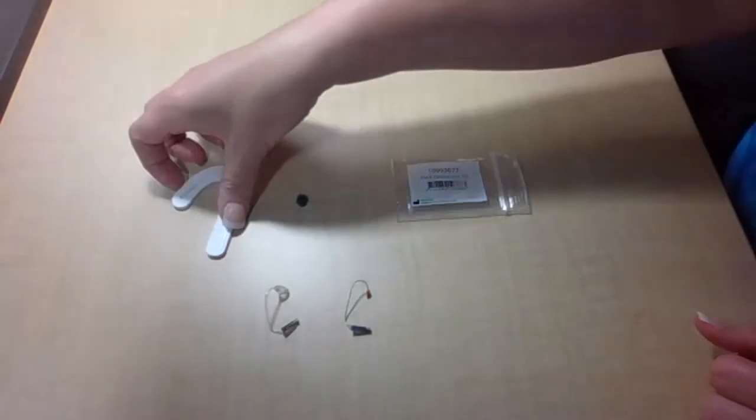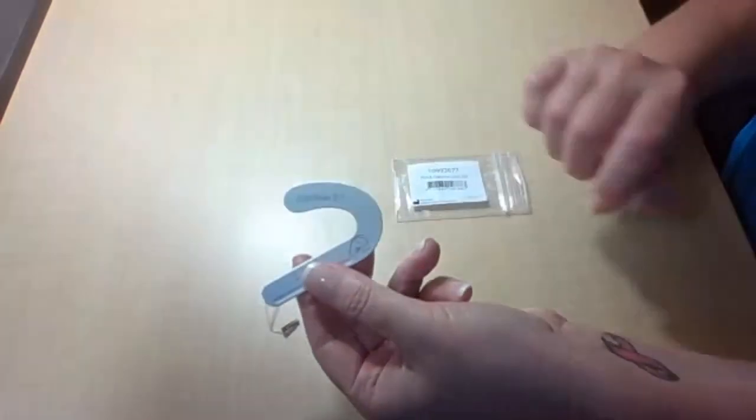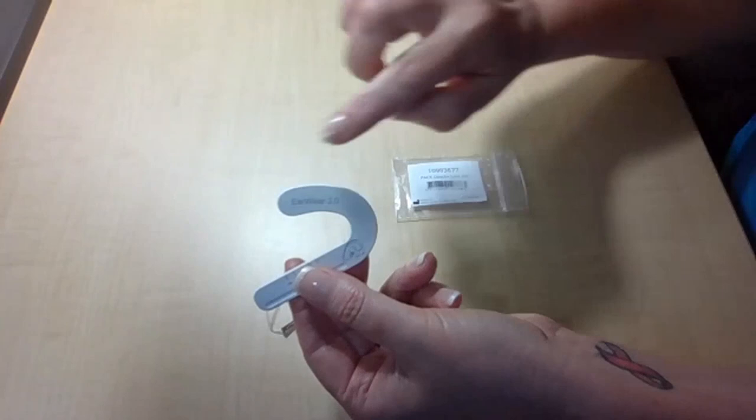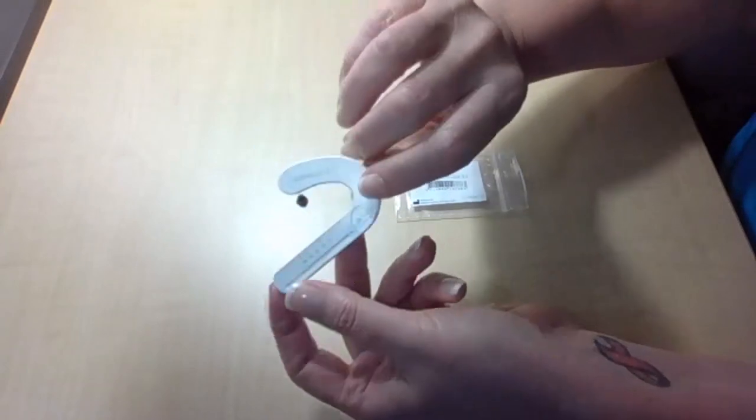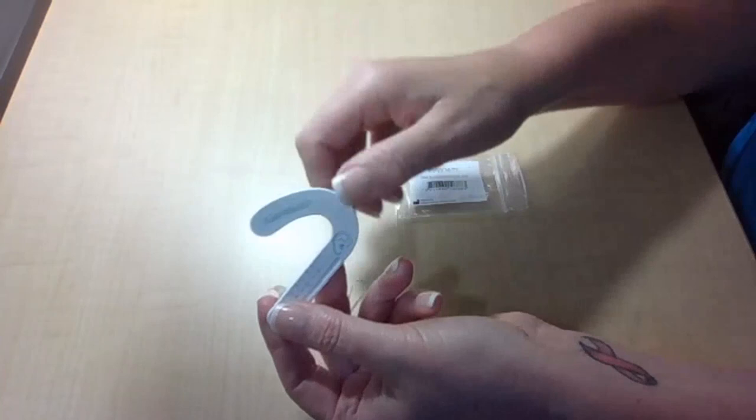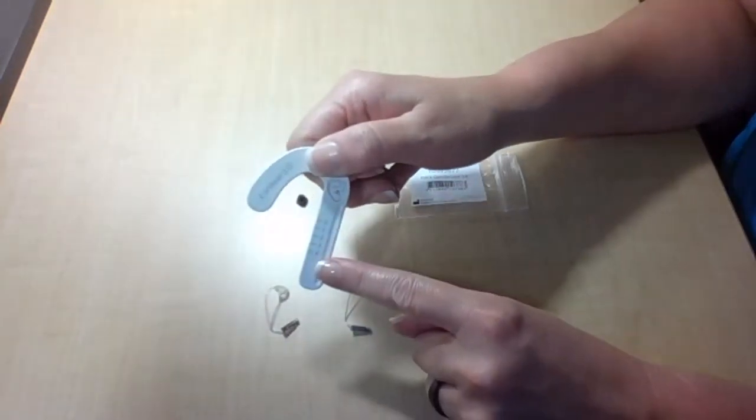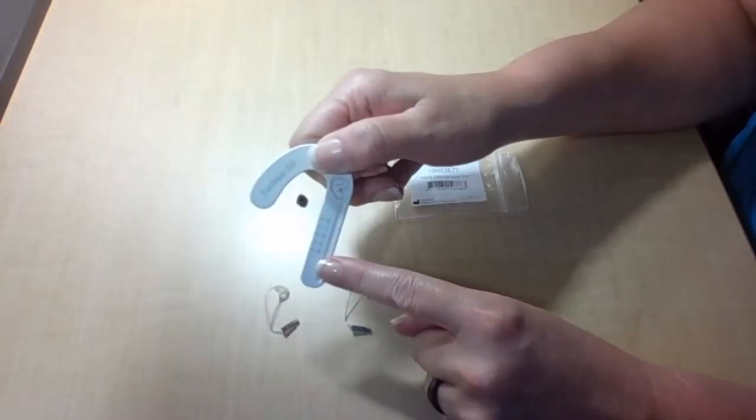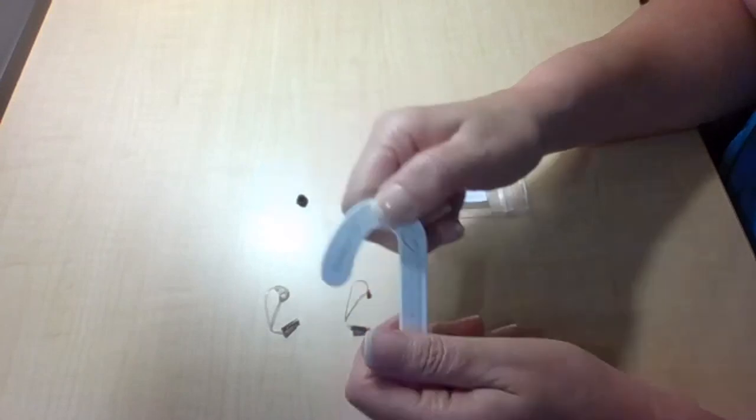With EarWare 3.0, you do have standard sizing for both those thin tubes and receivers, so you're going to use the new measuring tool that's marked with EarWare 3.0. And that shows sizes 0 through 4. Again, that's going to be standard across both thin tubes and MiniReceivers.